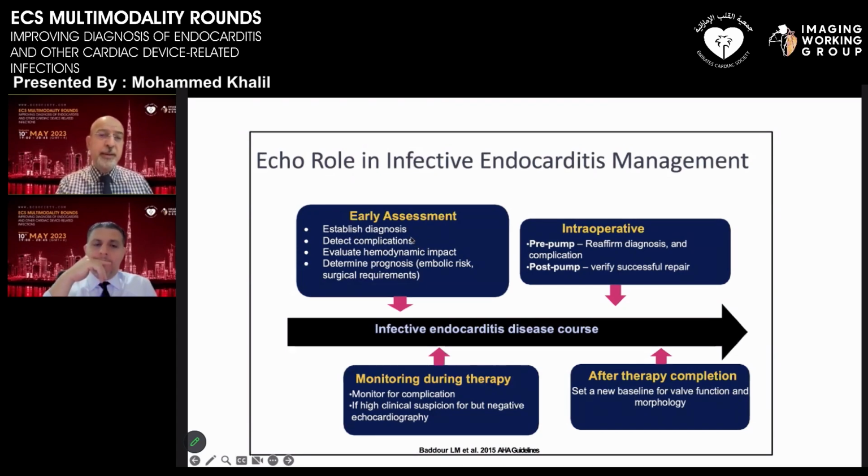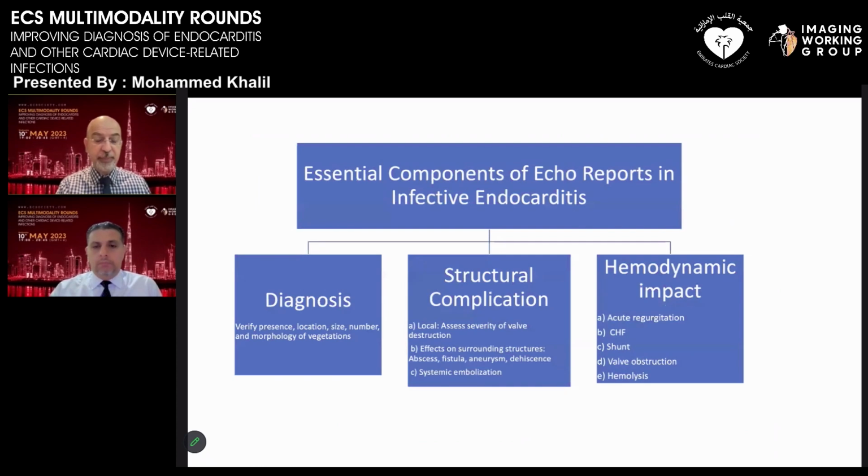endocarditis is essentially early assessment to establish the diagnosis, detect complications, and evaluate the hemodynamic impact; intraoperatively, whether pre-pump or post-pump, to verify successful repair; monitoring during antibiotic therapy to see if there are complications; and after therapy to get a new baseline for valve function and morphology as well.